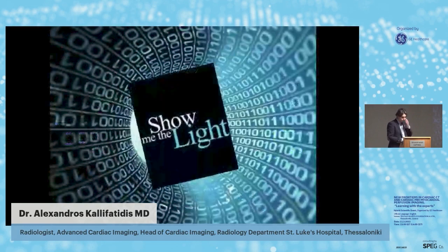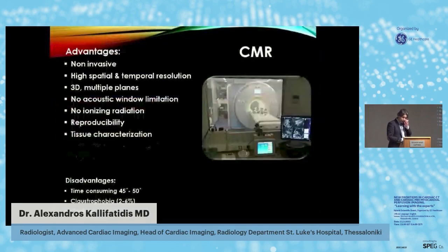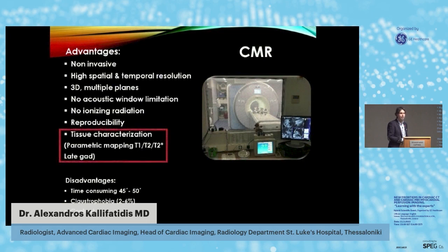And let's see what about cardiac MRI. And why cardiac MRI? Because it is a fantastic imaging technique with a lot of advantages. It is non-invasive, provides images with high diagnostic quality. We can scan the heart in multiple planes with no acoustic window limitation. And the main advantage is the tissue characterization, also with modern techniques and mapping.